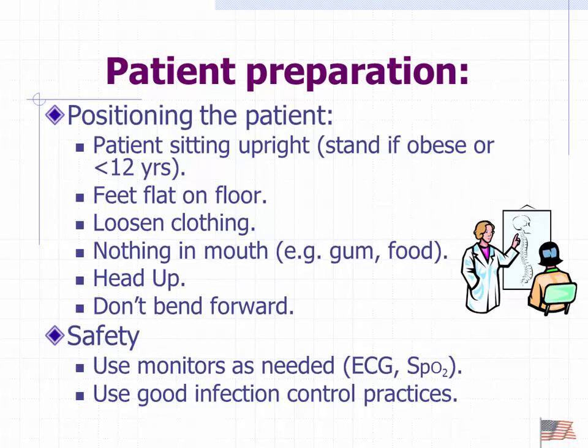Positioning the patient, they ideally should be sitting in a totally upright position, or standing if they're a child less than 12 or morbidly obese. Feet flat on the floor, loosen clothing. Please, no gum or food in the mouth. It's kind of hard to take a deep breath in when you've got a piece of gum in there, right? Head up, don't bend. If we're monitoring on a long-term basis, we'll have other monitors like pulse oximetry available, and most of the equipment we utilize is disposable, so it's not an issue.